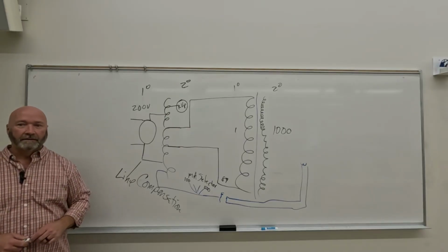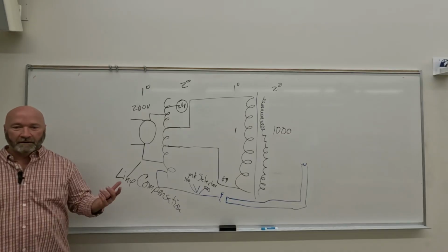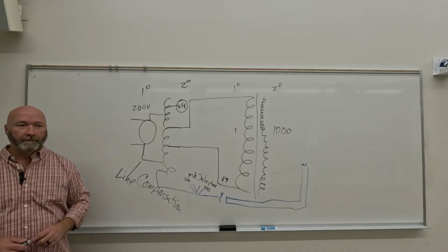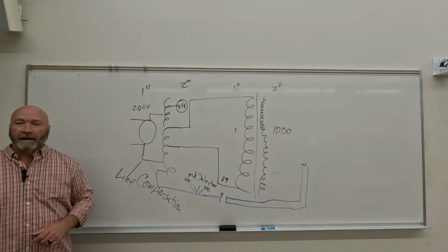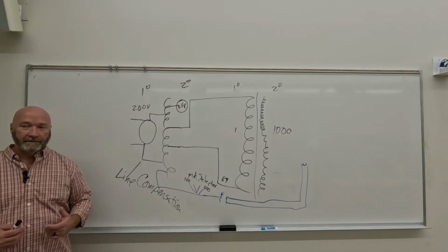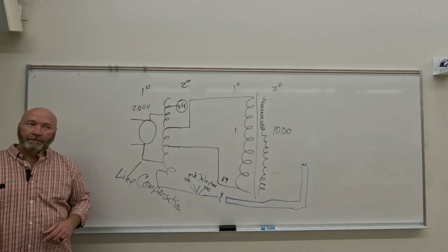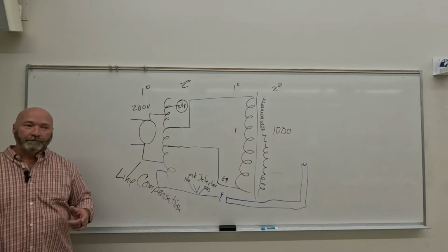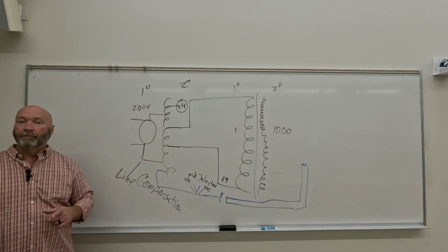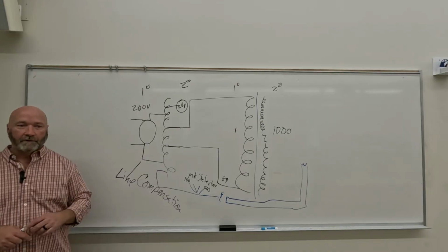You've seen a lung, right? What do they look like? They're dark, and they got squiggly lines all through, right? So if you've got a subtle fracture of a T-spine vertebra, you just can't see it all that well. But if you allow the patient to move throughout the exposure, or not move, keep them as still as possible, but breathe throughout the exposure, what's happening with those ribs and those lung markings?